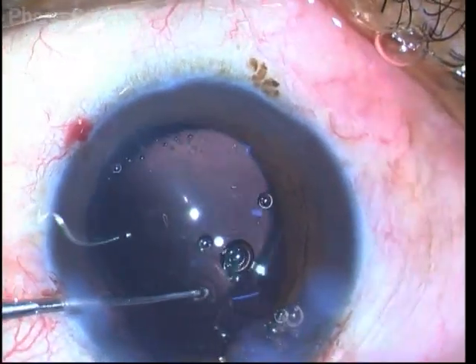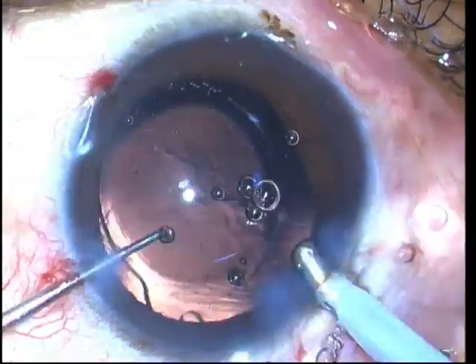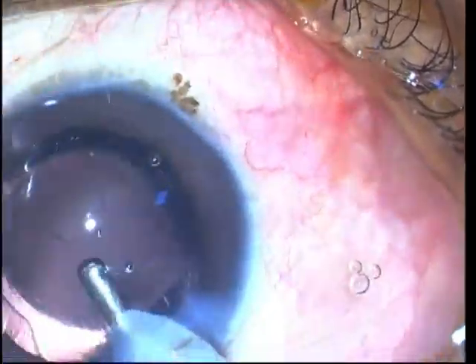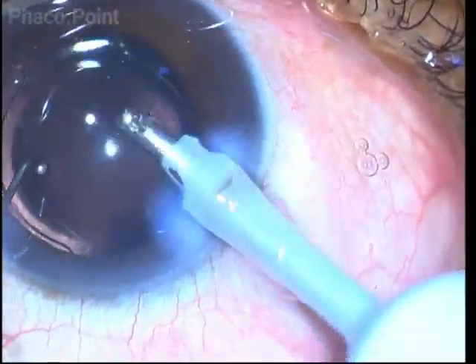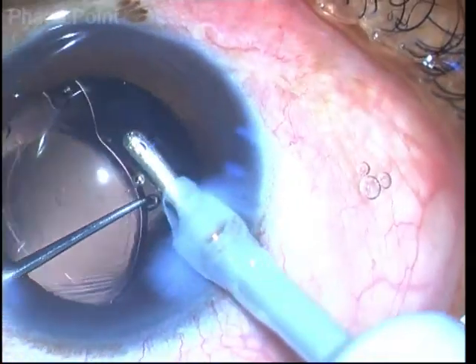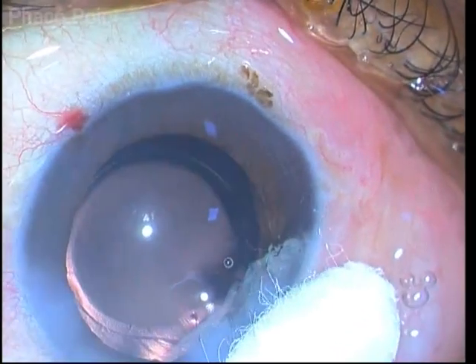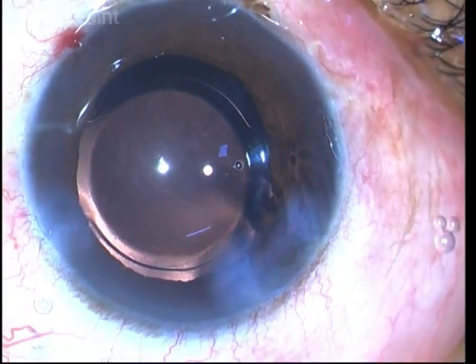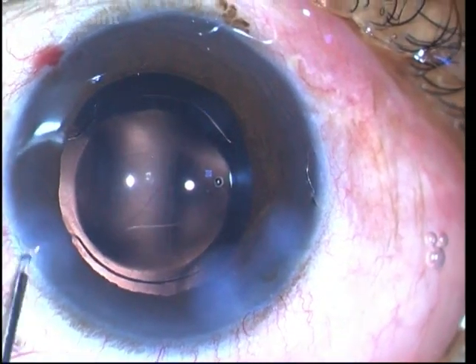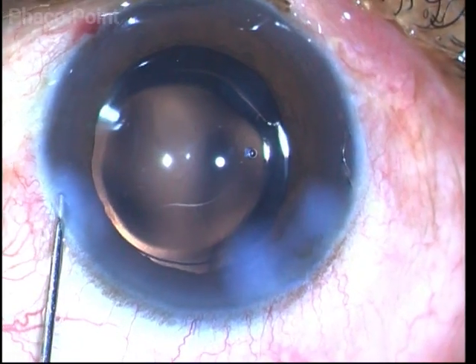Remember that the biggest challenges in polar cataract surgery are avoiding hydrodissection and performing proper hydrodelineation, for which you need a sharp tip beveled cannula. We need to properly manage the endonucleus. After the viscoelastic is washed out by burp compression, the wound is sealed and the polar cataract has been successfully managed.